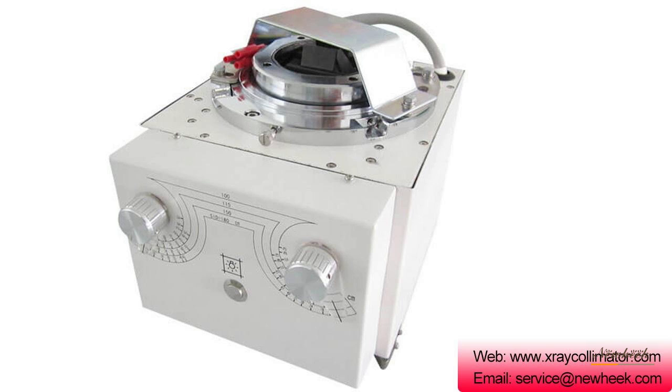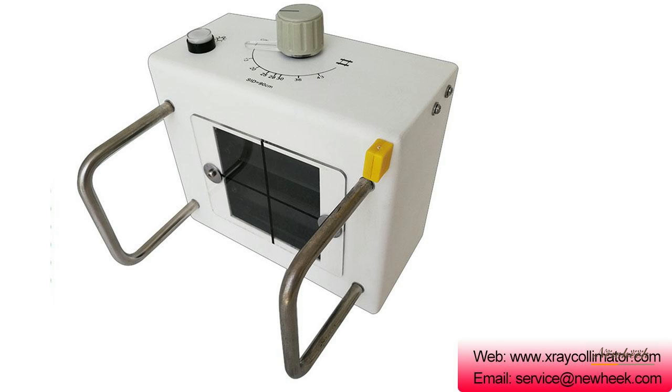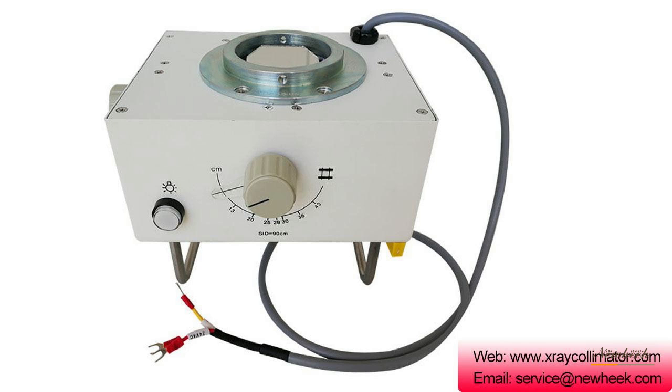The manual x-ray collimator is an essential part of x-ray diagnostic machines and can be applied to the following situations. First, it is used in x-ray therapy machines to block x-rays and protect normal cells from radiation when the diseased cells are being irradiated.